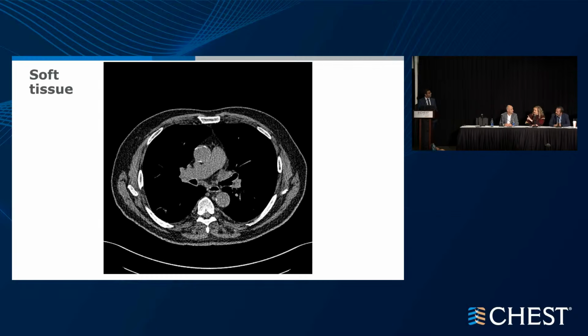But I'm going to ask, is there a PET scan? Yes. There probably is. The other thing that we might talk about here, it looks like there's some station 5 disease or station 6 disease that is not going to be accessible probably to us that could come into play here. Yeah, exactly. So yes, Dr. Lamb, there was a PET scan, and the way I got this was very different from how it came to me. But if it had come to me first, this is exactly why I want to bring it up as an interesting case from that perspective.